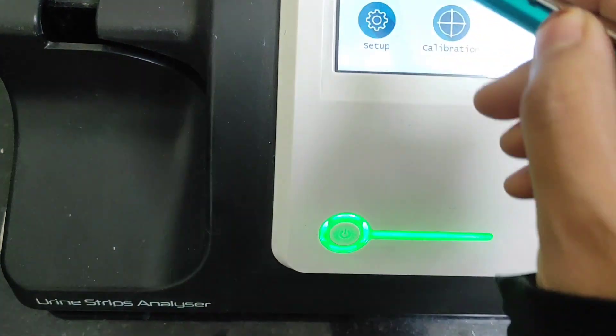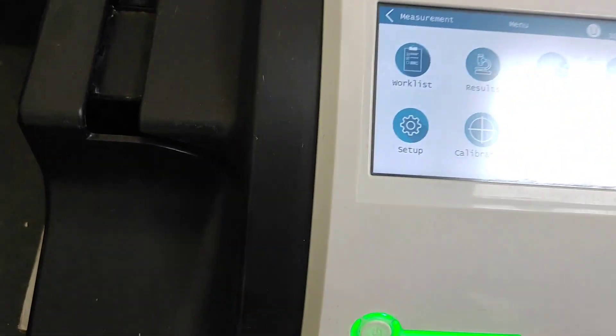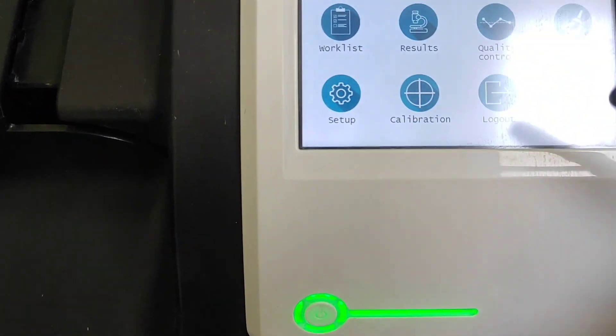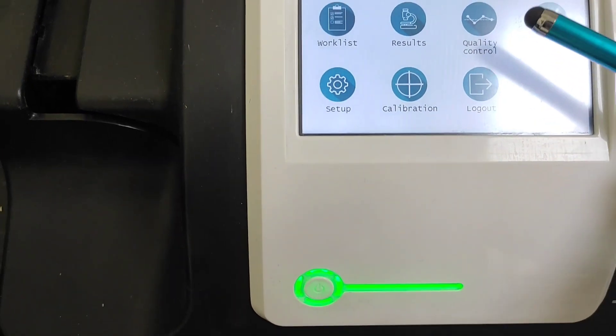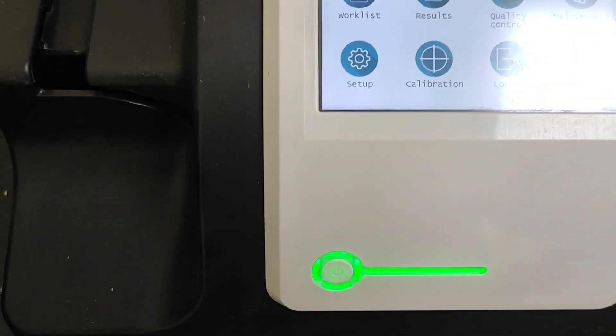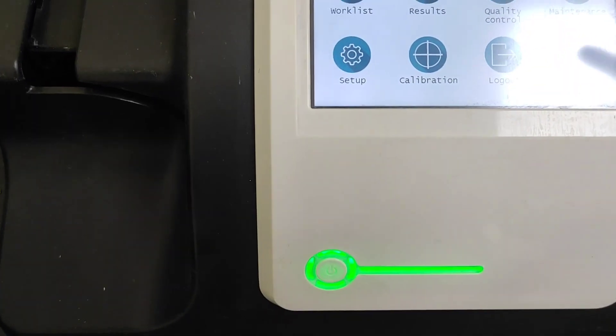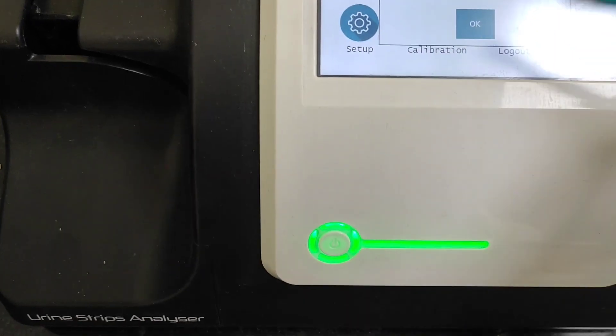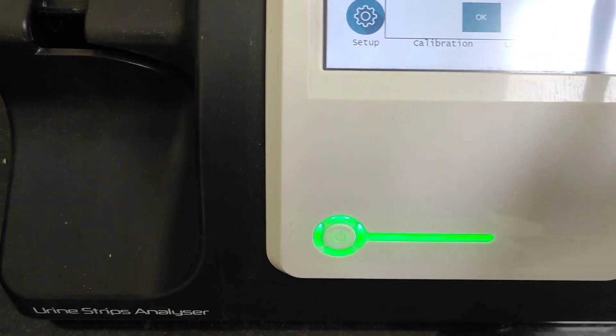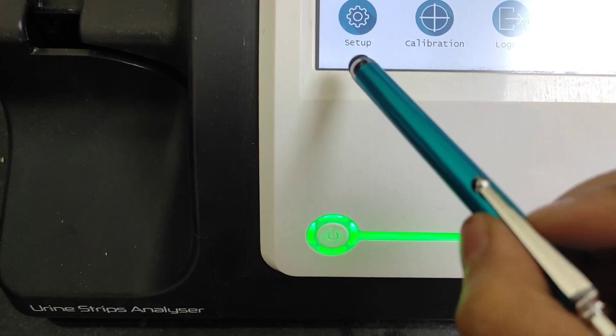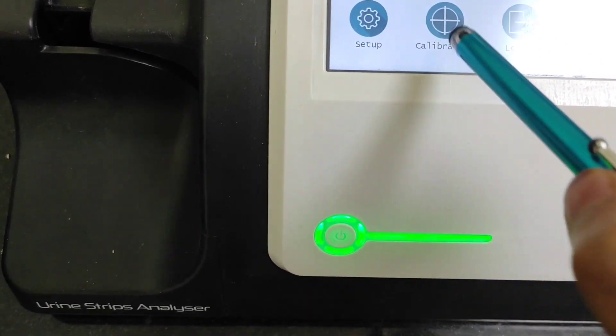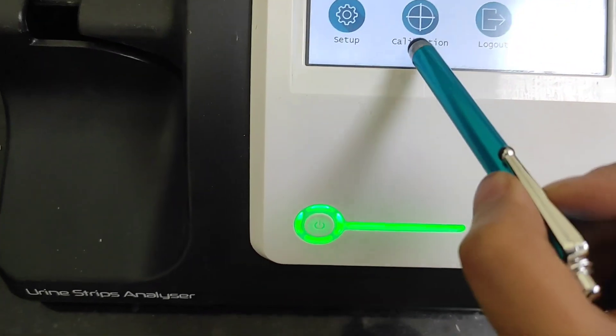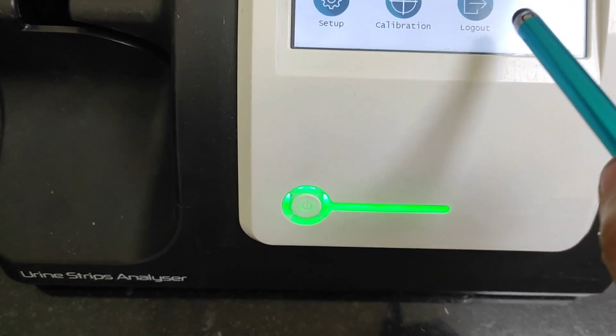If you want the measurements, you can go here. The number of tests that you have performed, if you want to check the results you can go here. Quality control that you have to run, we have already run the quality control. The maintenance of the machine you can go here. And the calibration you have to go, and log out.